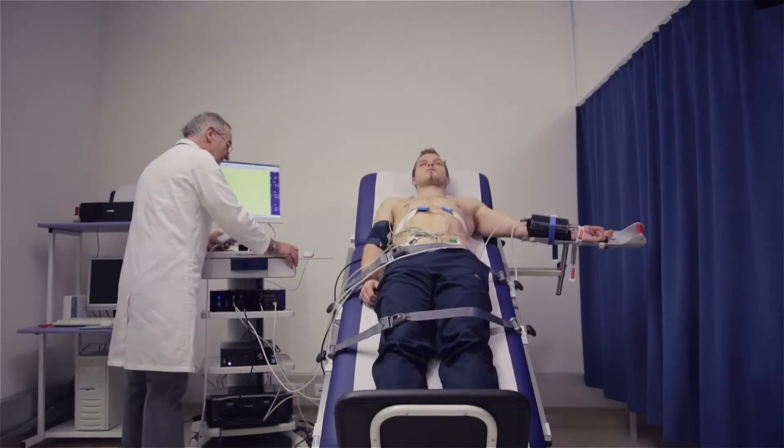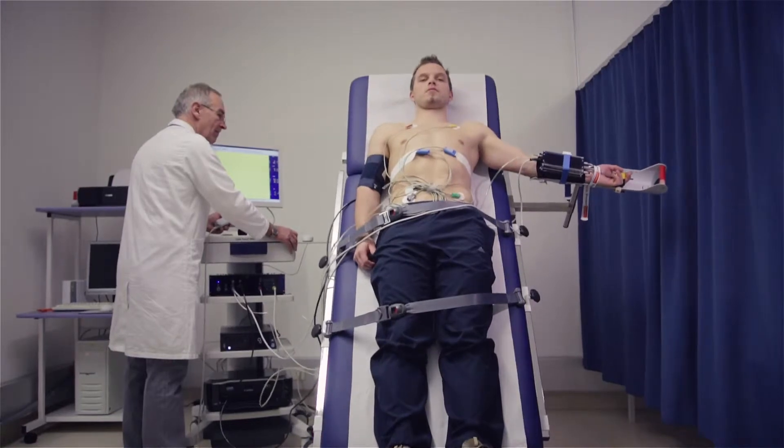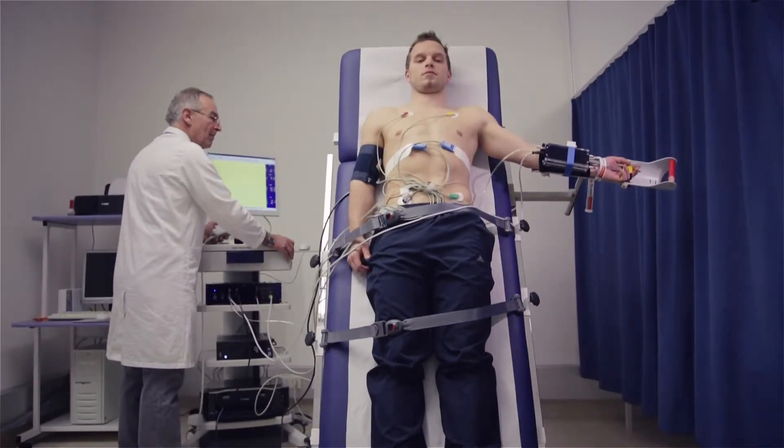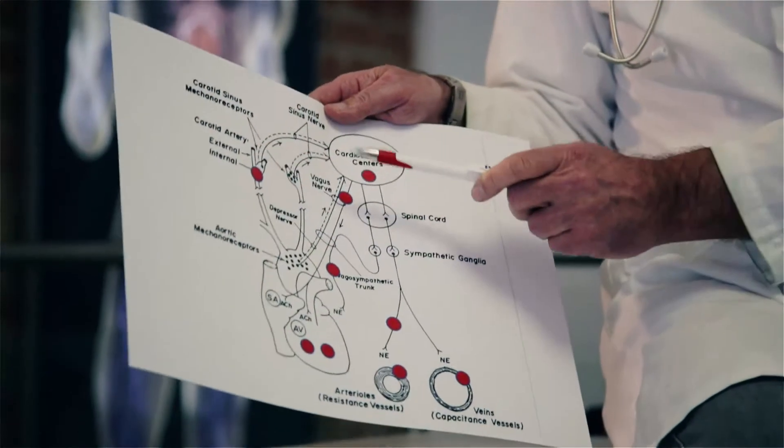The Task Force Monitor has achieved what no device has yet managed — namely to examine all of these organs together with non-invasive measurements. We can examine inotropy of the heart or stroke volume, and we can see the baroreceptors controlling blood pressure and sympathetic outflow. We can gain insight into the brain stem, measure vagal outflow to the heart, the signals from the peripheral resistance vessels, and information about the function of the veins.